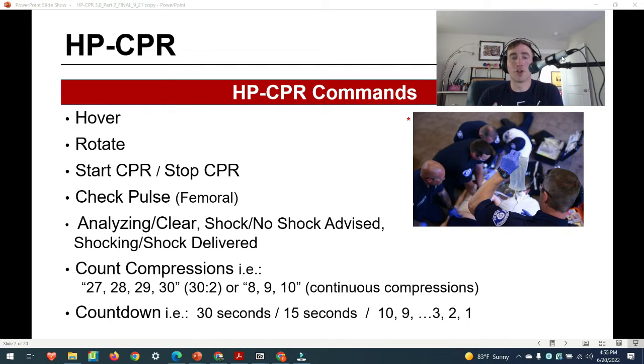And you should announce pre-charging, continuous CPR, because we work with a lot of different departments, who also have their own turnover rate, right? So they're struggling to keep people as well. And it's going to be impossible to train every single person at every single department as soon as they're on board. It's just logistically impossible right now. So you have to communicate these things effectively, and you have to be loud.